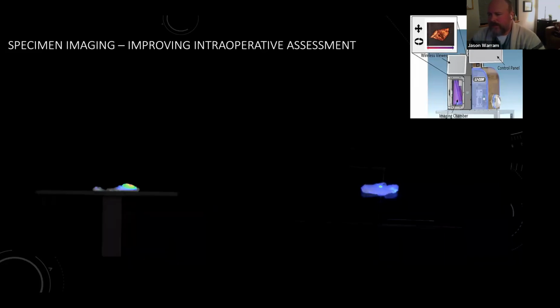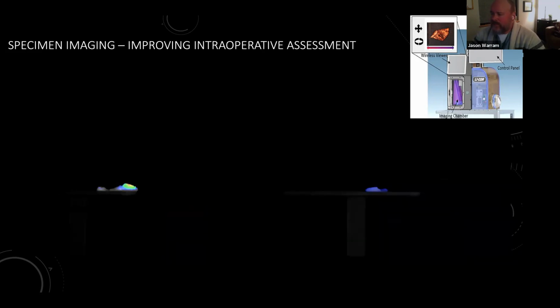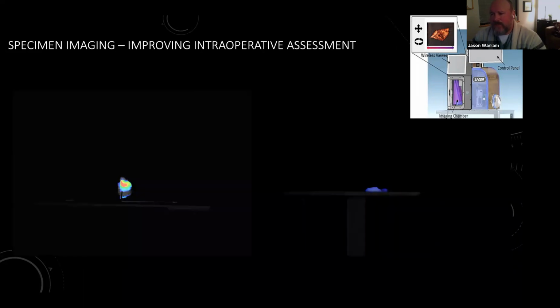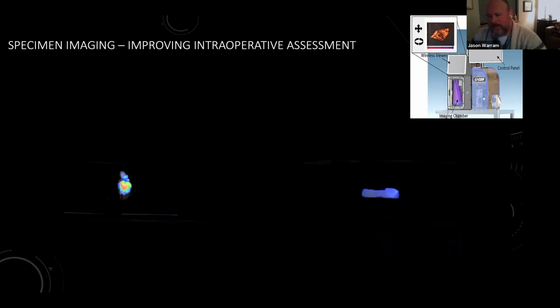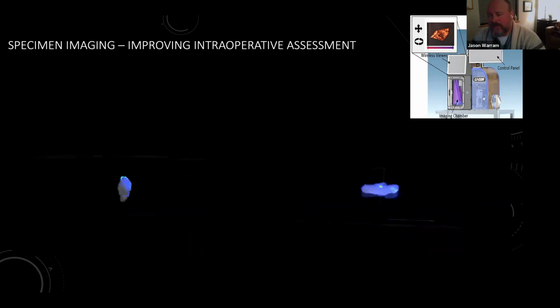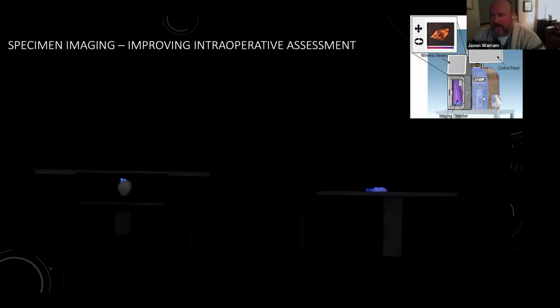So one of the things we're doing here is, even when the main specimen where the primary is sampled in different areas to make sure there's no disease at the cut edge, we are taking those blocks and imaging them. So we're imaging the tissue that wasn't selected for histology. And we're showing the pathologist there are suspicious areas in this block because the fluorescence is still alive. Then they go back in, cut a few more sections, and lo and behold, they find tumor. This is what the FDA wants to see. This is us making those steps, because left-behind cancer is already known to reduce long-term survival.